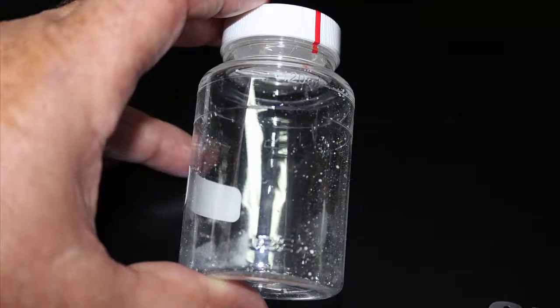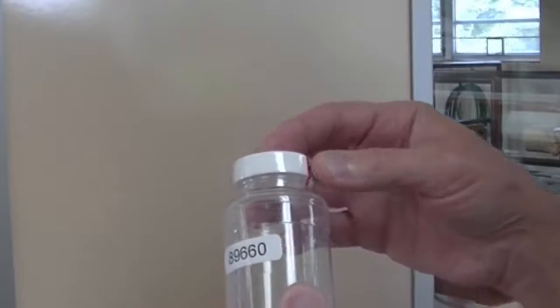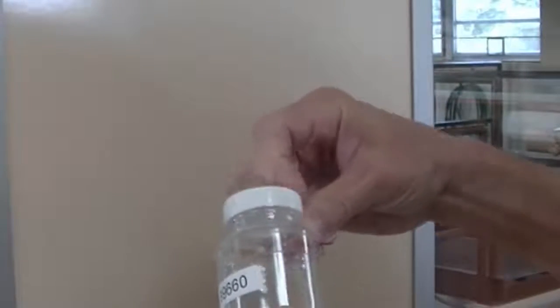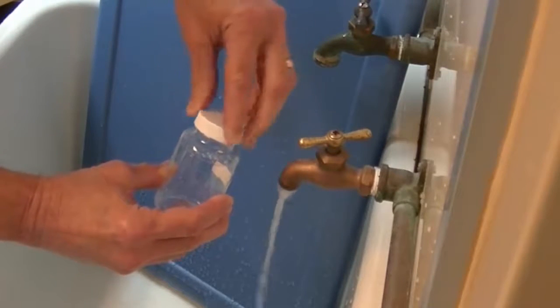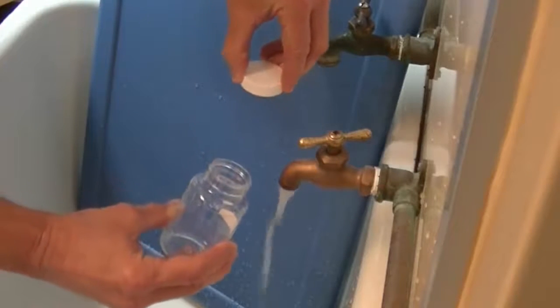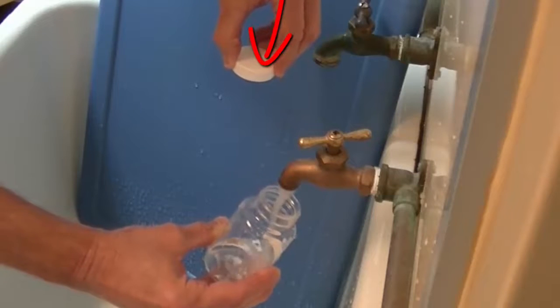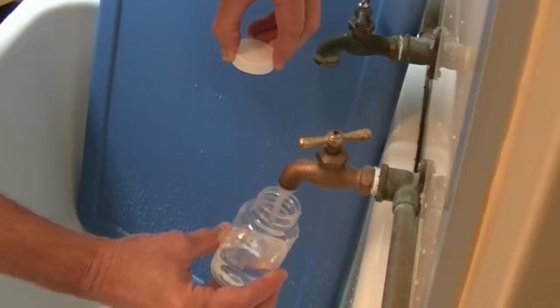Use a sealed BACT sample bottle which you receive from the State Department of Health. Bottles include a chemical for neutralizing chlorine, so do not rinse the bottle before collecting your sample. Carefully break the sample bottle seal by pulling down the red tab to remove the shrink wrap. Unscrew the cap and hold it away from the flowing water, facing the same direction as it was when on the bottle, threads facing downward, so that dust does not collect in the cap which could introduce coliform bacteria to your bottle.